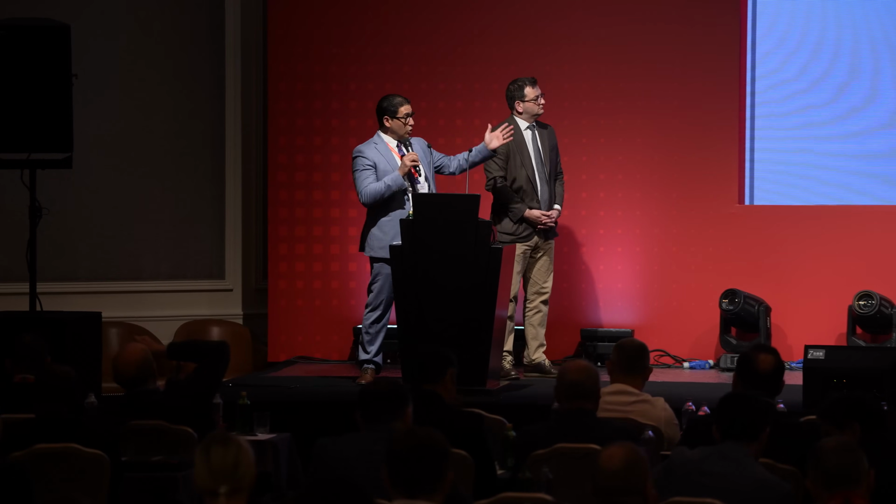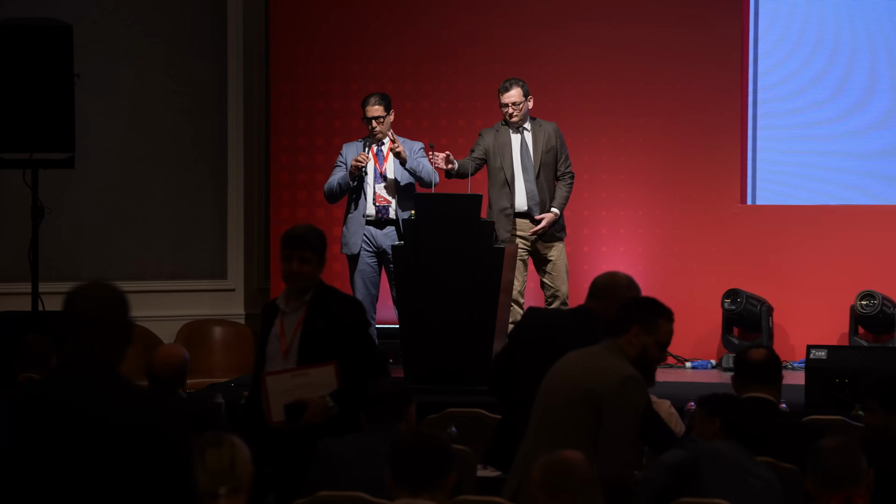This is a very good question. So I'm going to step back a bit. If you are doing multiport robotic, let's say Xi or dV5 low anterior resection, and I do my own lateral pelvic lymphadenectomy for metastatic extramesorectal rectal cancer, it's not uncommon to encounter this bleeding, and you can work on anything except two areas.